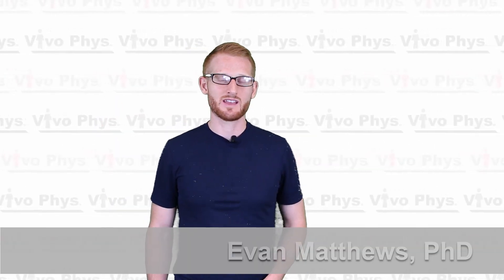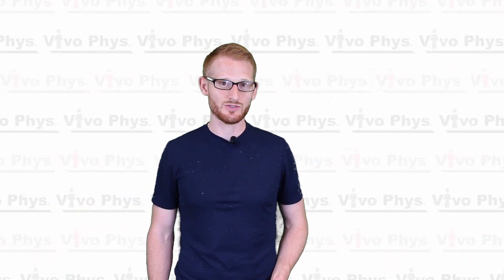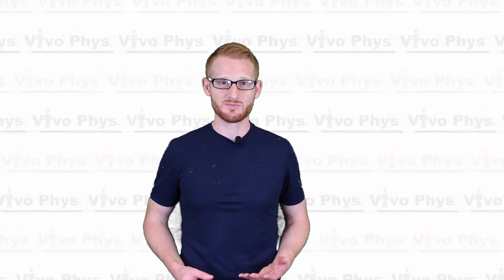Hi, I'm Dr. Evan Matthews and I'm here in the Exercise Science Lab at Montclair State University. Today I'm going to be showing you how to use bioelectrical impedance analysis using the Tanita scales to do a body fat percentage measurement.